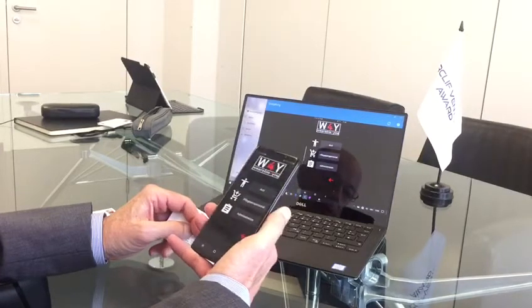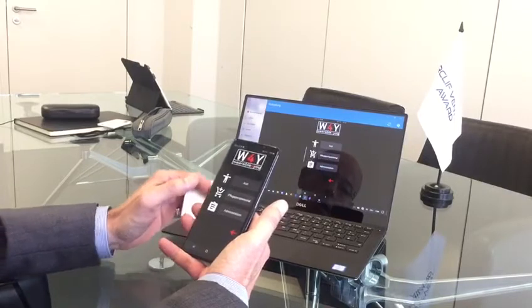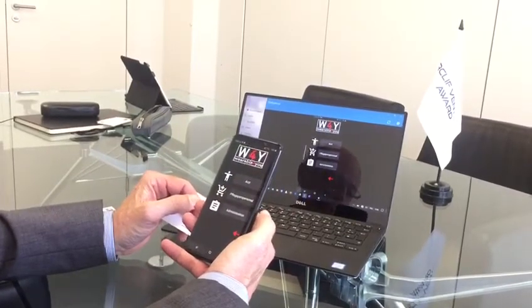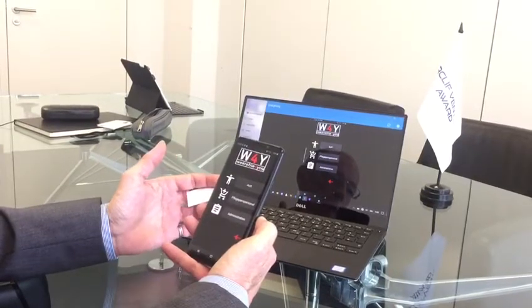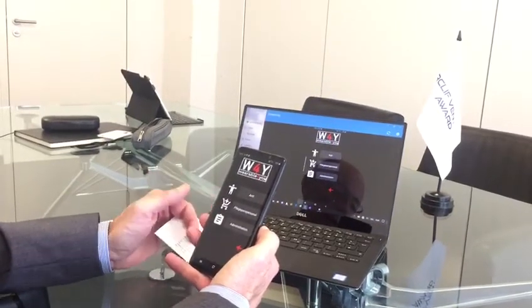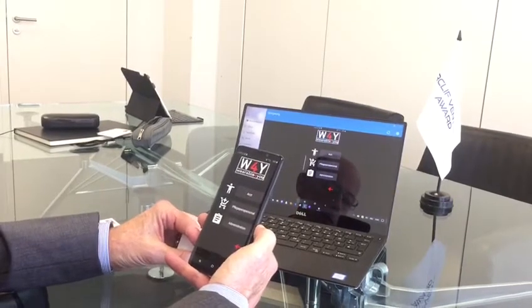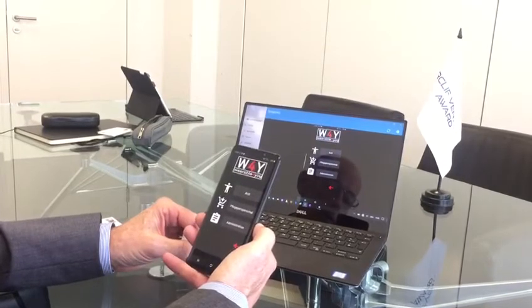So that's the purpose, or that's the function for the doctors. Obviously, we can implement a different submenu, which is for the nurses, who will have access to different data of the patient. Some data is restricted to the doctor only. Some other data will not be interesting for the doctor, but for the nurses. And a similar thing for the administration.